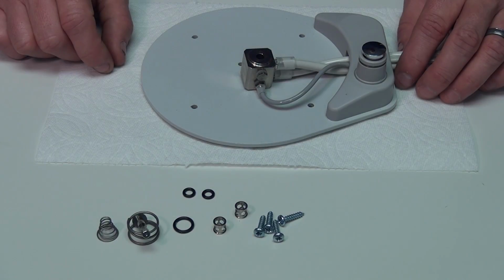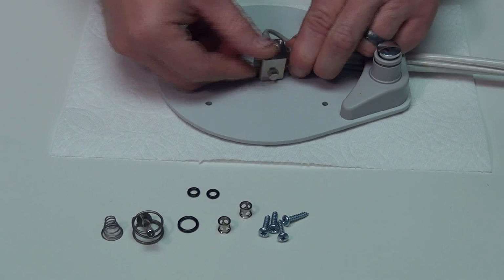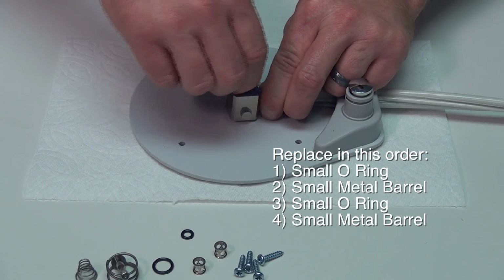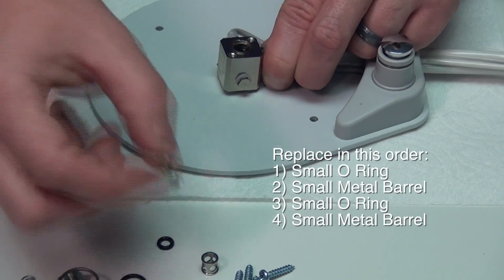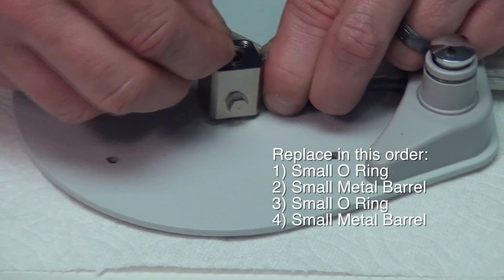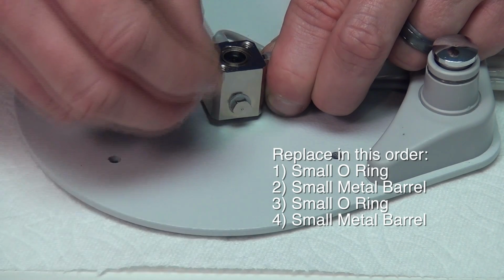Once all old parts have been removed, flip the square metal housing upside down. You're going to grab one small O-ring first, place it inside the hole, followed by 1 small metal barrel with 1 more small O-ring, and then the last small metal barrel.